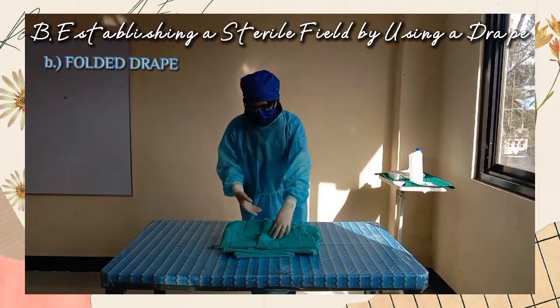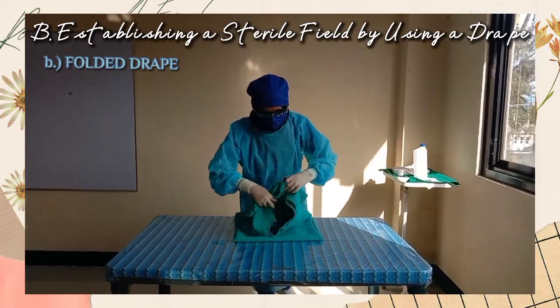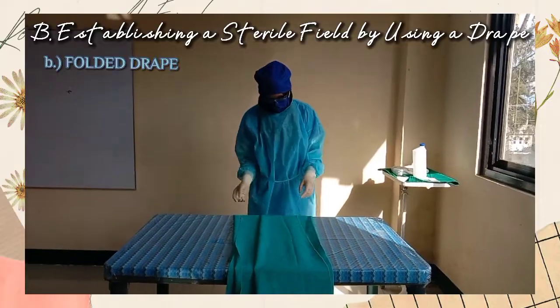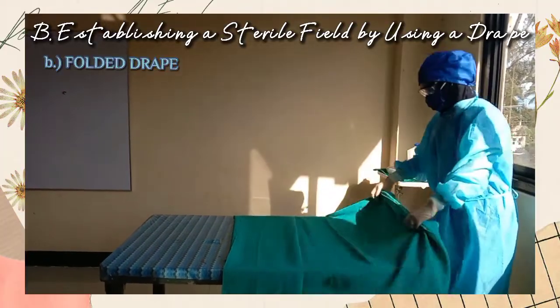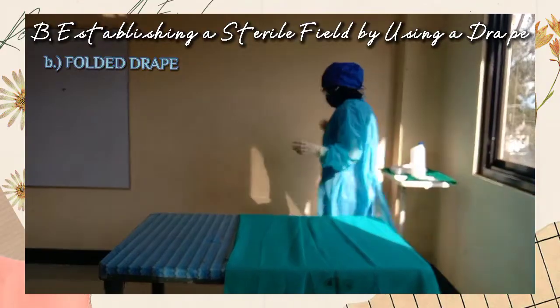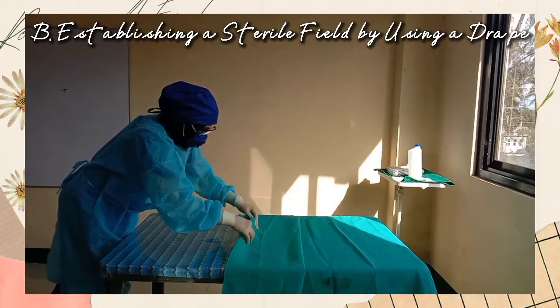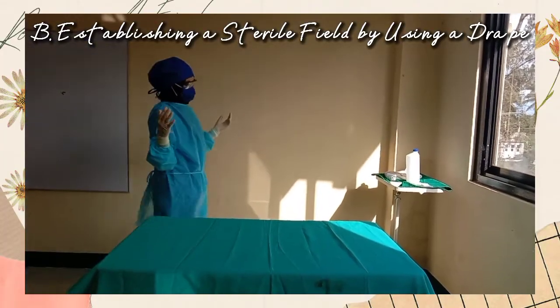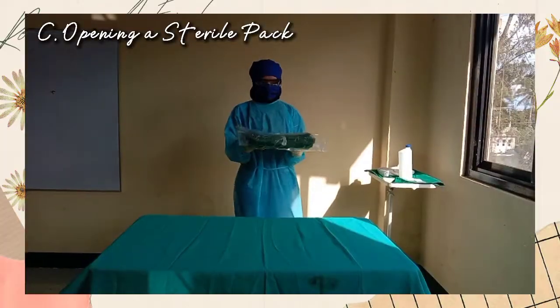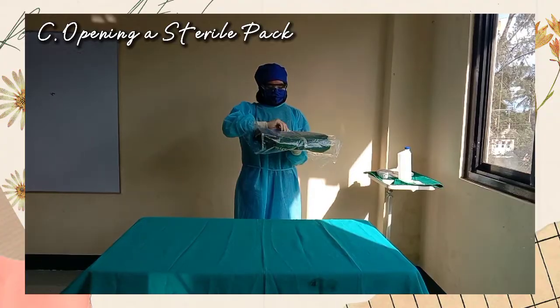Unfold the drape towards self first. When completing the coverage, the rest of the drape is unfolded away from self. Unfolding toward self first prevents leaning of the near unfolded drape when the nurse tries to unfold the far side. The scrub person stands back from the unsterile table when draping it, to prevent the gown from touching the unsterile table.